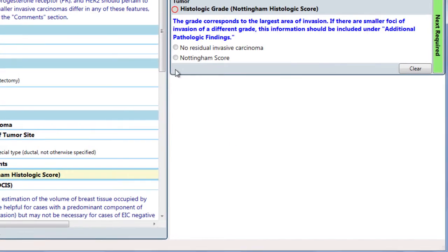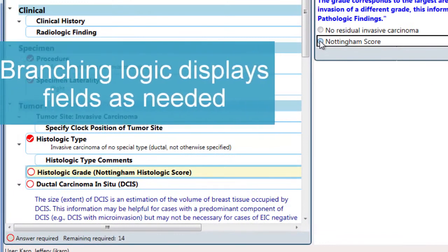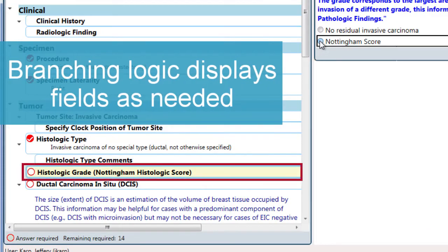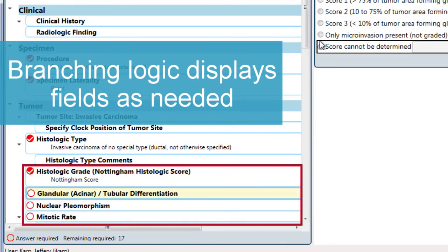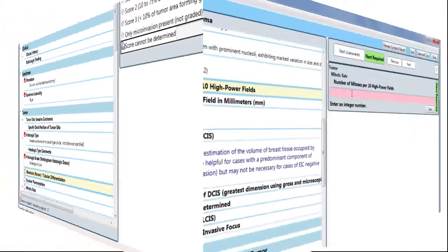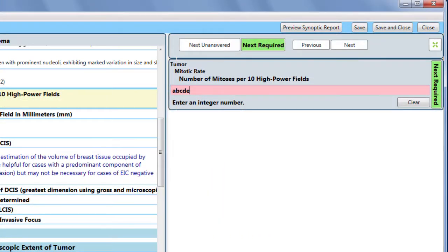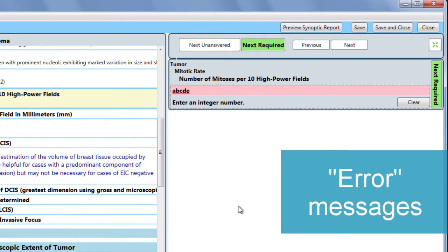E-Form uses algorithmic branching logic that displays fields only when needed, making the experience more streamlined. Error messages pop up to ensure that you enter valid data.